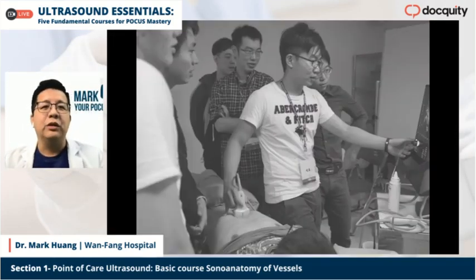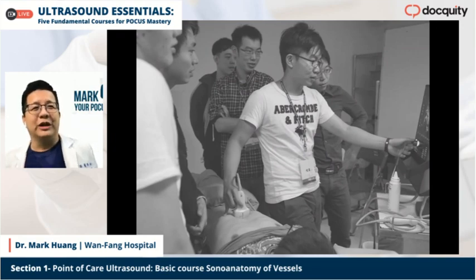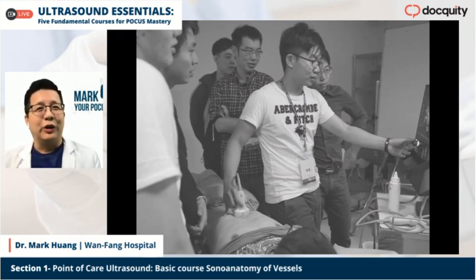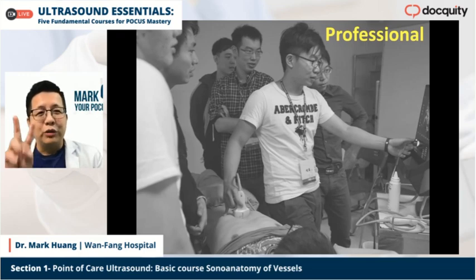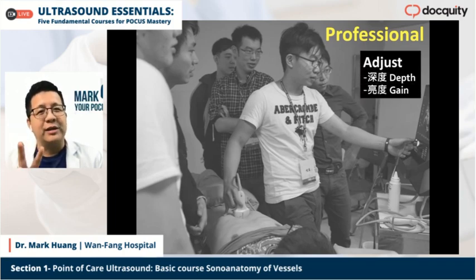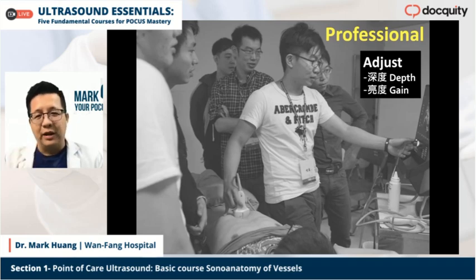If you understand how to do that, you will have some chance to do it on your own, especially if you don't have much experience, but you need to do it. At first, I always teach my medical students, you need to look very professional. The only two buttons you have to know on your controller are to adjust the depth and the gain.